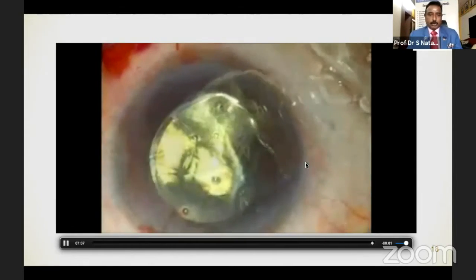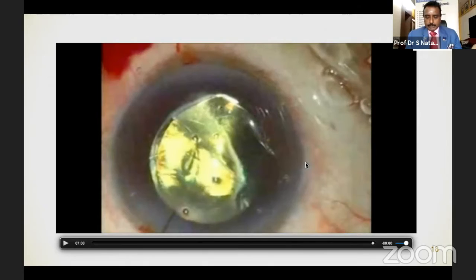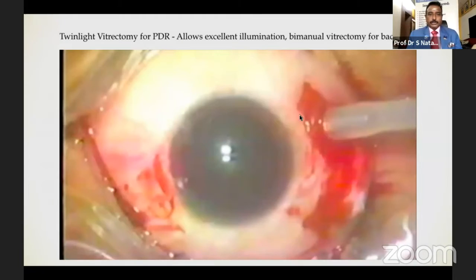I think in this eye I didn't use oil. We left the eye with air, and it was pseudophakic at the end. And this is the final video, I think.